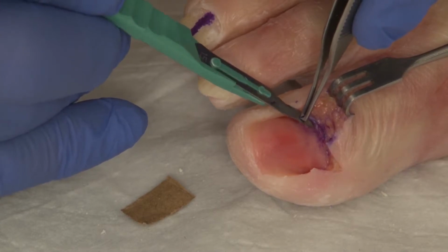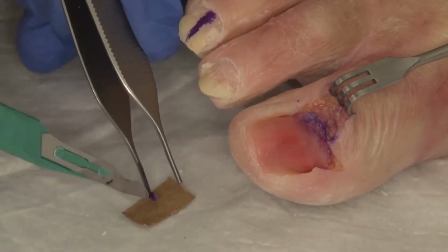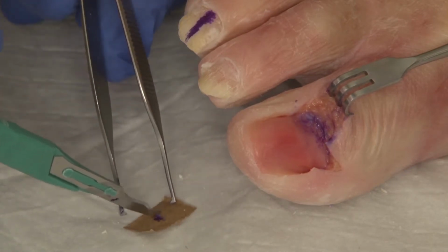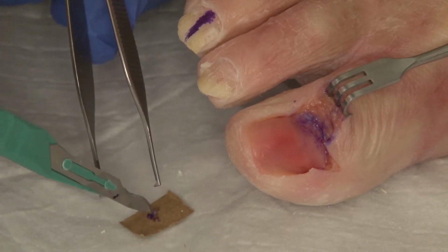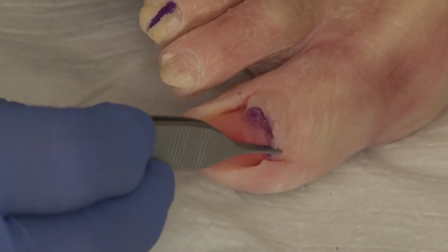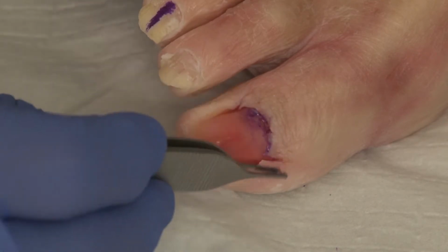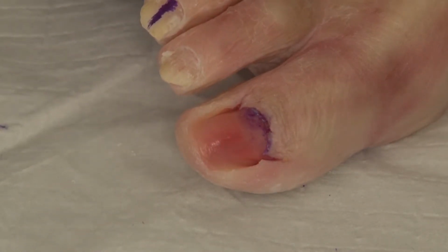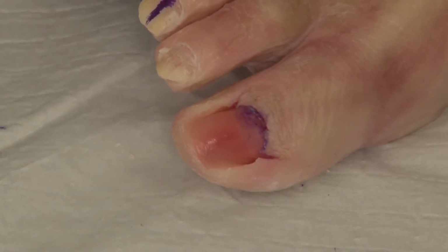Now that we have completed the cut, the specimen is elevated and placed on a cardboard so that it doesn't curl upon itself, and the specimen like that is put into the formalin bottle for dermatopathology analysis. The proximal nail fold is then brought back into position and can be anchored with 2 simple sutures on either side, and a topical antibiotic ointment dressing applied. Follow-up would be anywhere between 5 and 10 days, and the procedure is completed.